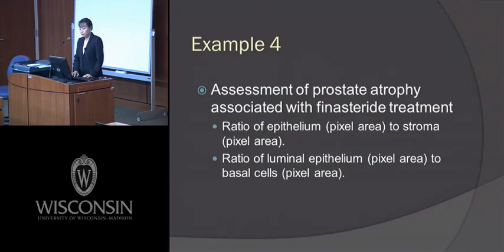So in this one, we try to assess prostate atrophy associated with finasteride treatment. What I did is I used some substitute factors or parameters to estimate the atrophic status by measuring the ratio of epithelium to stroma and the ratio of luminal epithelium to the basal cells.